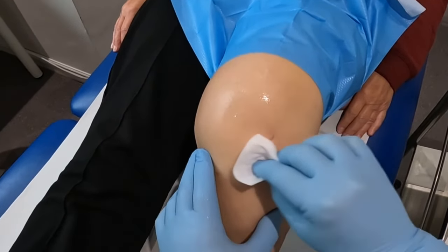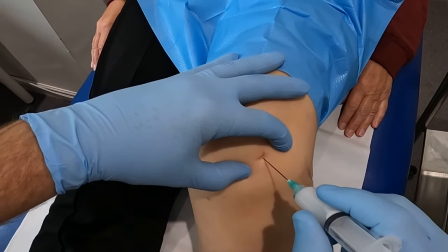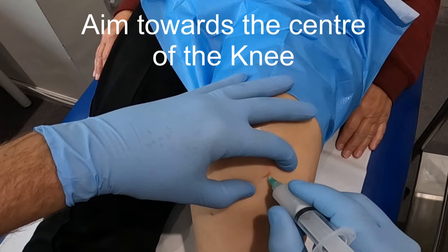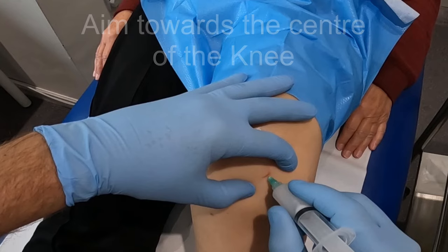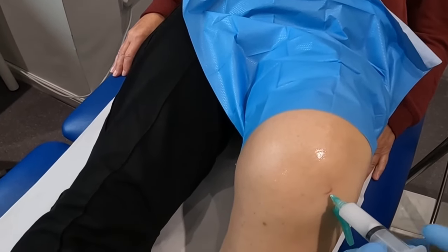Sterilise the area, stretch the skin with your free hand, and then introduce the needle decisively in order to minimise pain. The needle should be directed medially towards the centre of the knee joint. Perform a safety aspiration and then deliver the injection as a bolus.